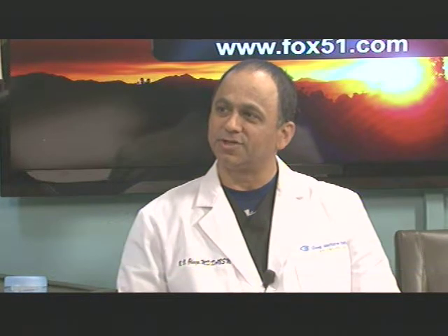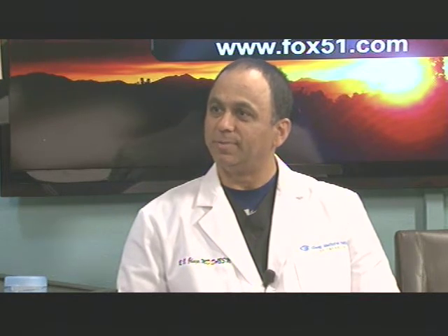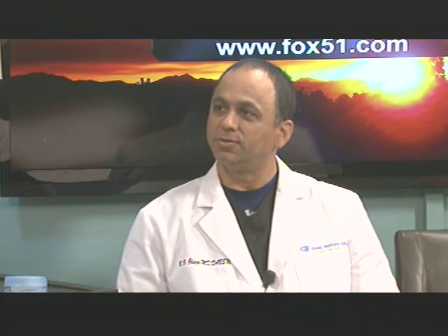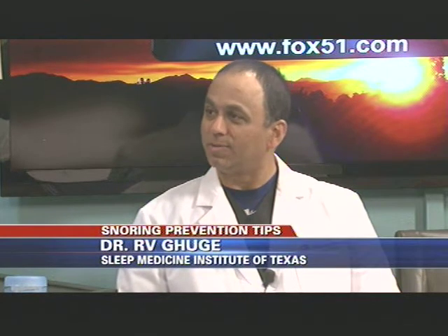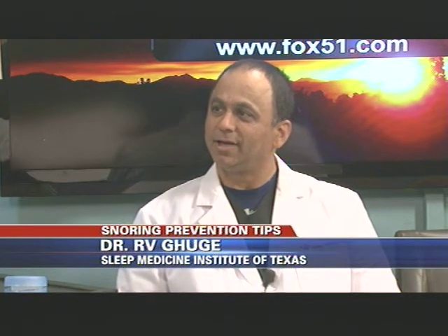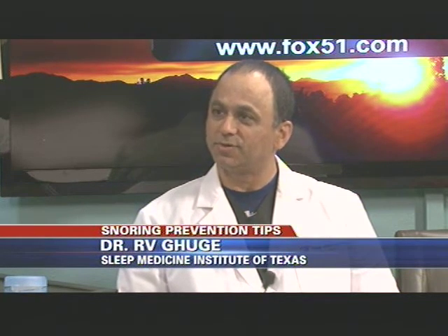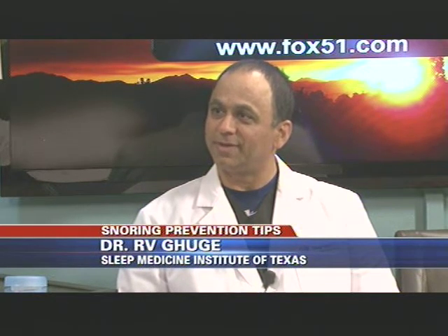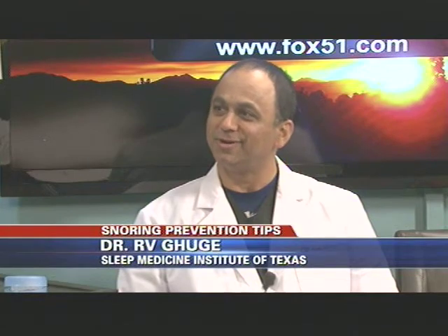Traditionally, we have treated sleep apnea with a PAP device that helps you breathe better when you sleep, and it eliminates the snoring. But over the last several years, we've started to use an oral appliance. We call it a mandibular advancement device. It helps to stabilize the position of the jaw and does not allow it to fall back in your sleep. And so it helps reduce snoring and reduce apneas.